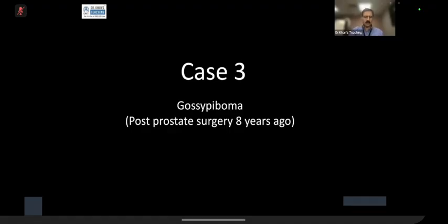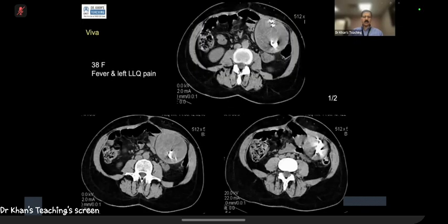The case tells you a story. These are favorites for the exam. A case which tells you a story. You have to think what the story is. I'll come back to the case.